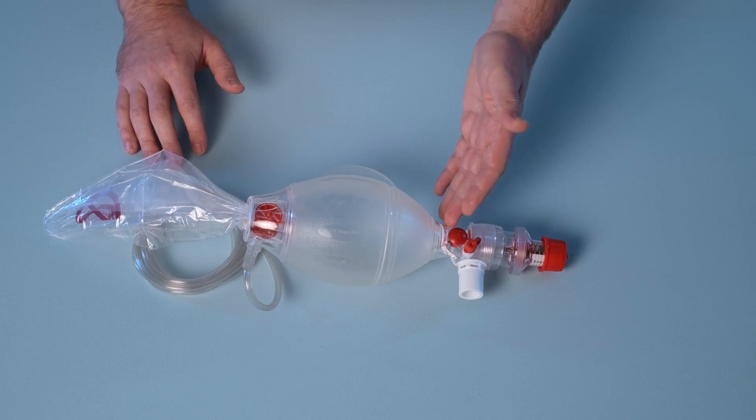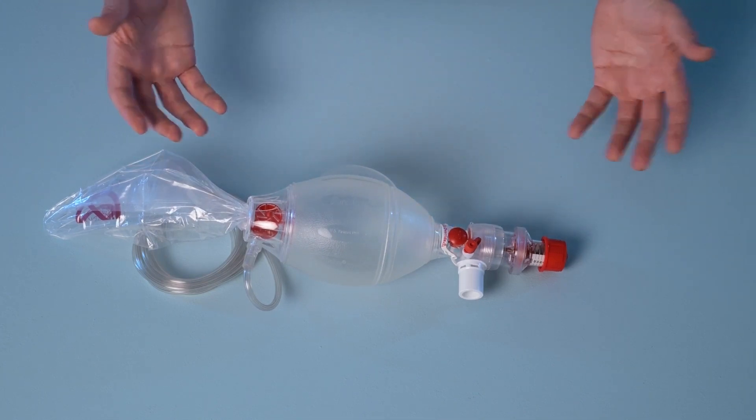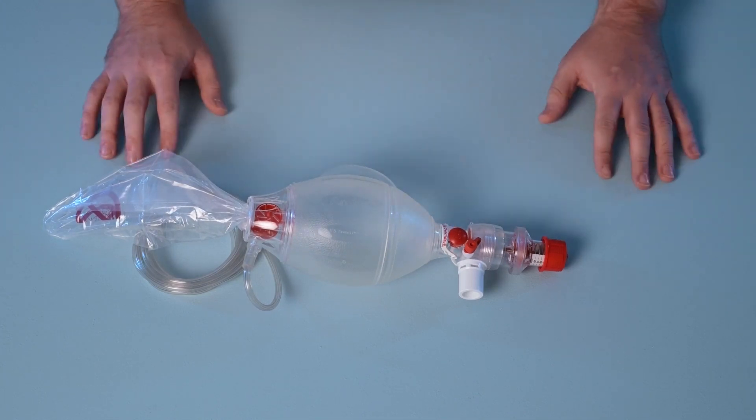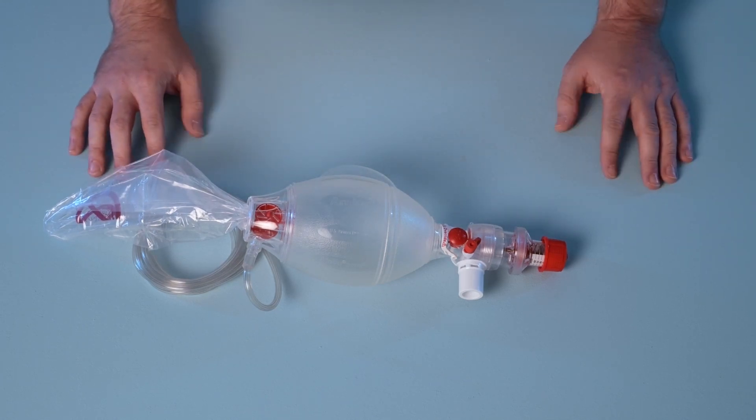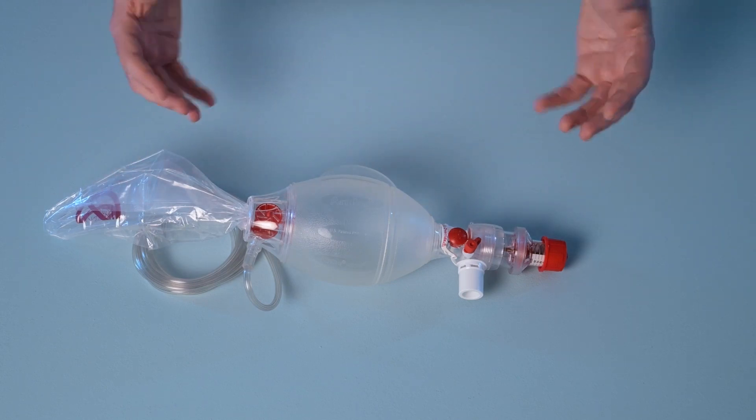An override clip is included which can be engaged to prevent the activation of the pressure limiting valve, and this can be used in cases where higher ventilation pressures are required in order to achieve suitable ventilation.